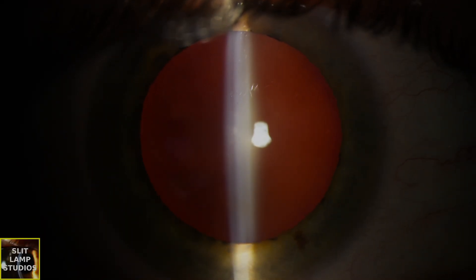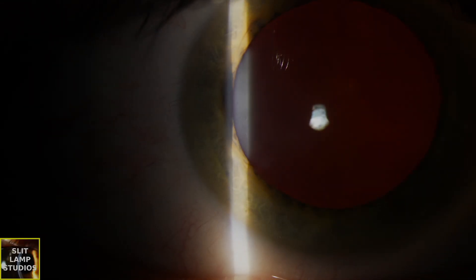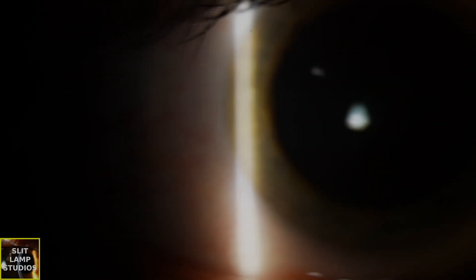We need to examine the patient very carefully to identify this tear. You can actually see that vitreous movement even through the pupil and retroillumination there.